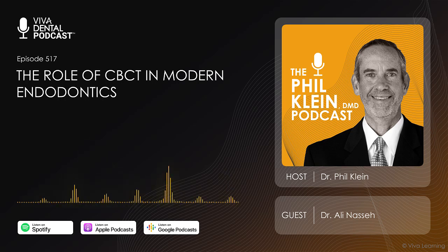In fact, the American Association of Physicists in Medicine put out a position paper saying that the ALARA principle and a lot of these things that we've been touting for many, many decades are really obsolete, and they're really not helping people. They're just scaring them from making decisions that actually help improve the quality of the care their surgeons provide, by creating this scary atmosphere.